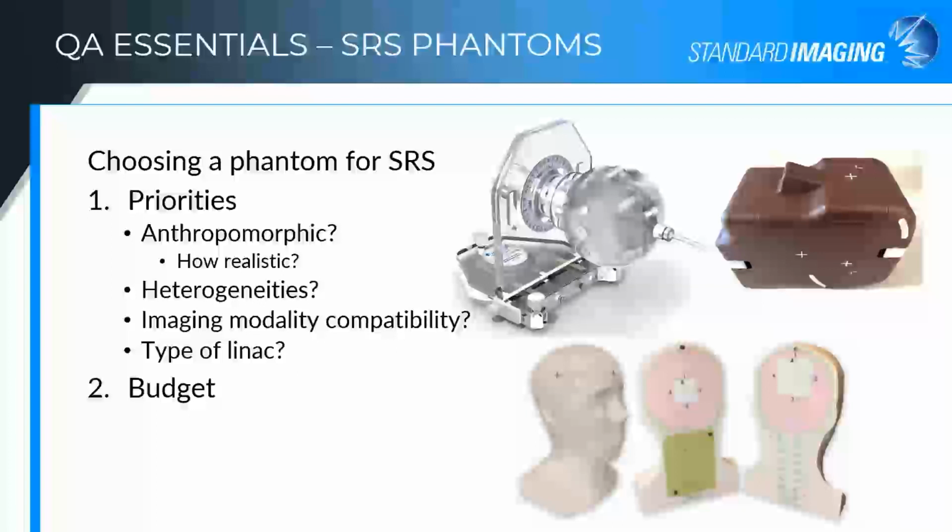Again, your heterogeneities, are they embedded? What are they made of? How many of them are there? What shapes they have? Maybe that matters. That's a consideration.